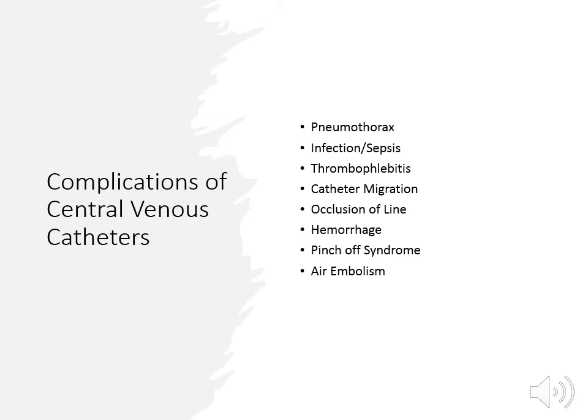So what signs and symptoms might you see? You want to watch for infection, redness, drainage at the site. Provider must use strict sterile technique during insertion. The nurse must change the IV solution, tubing, dressing, catheter caps per protocol as delineated by the infection control at your facility. You want to use evidence-based practice when you're bundling your interventions, including hand hygiene, clean gloves, scrubbing the hub, and accessing the site and the line.